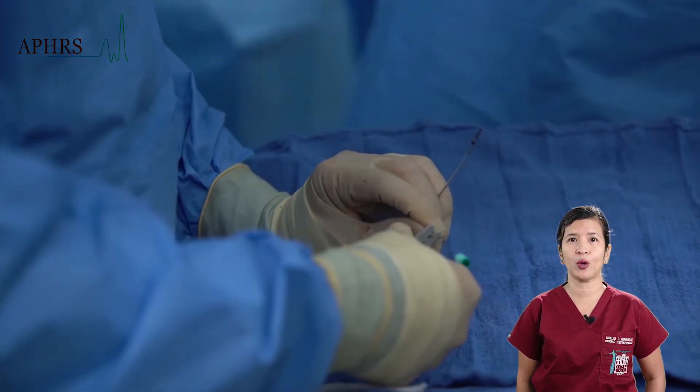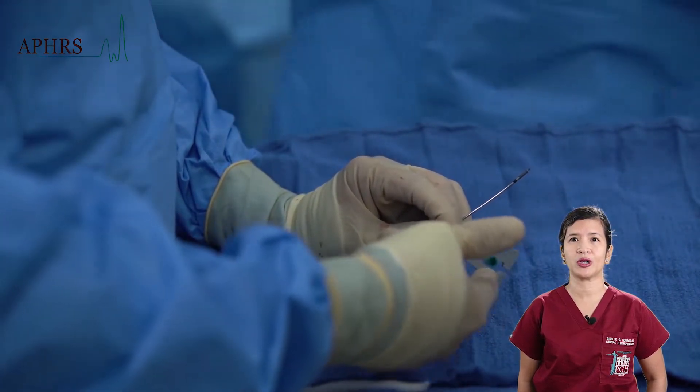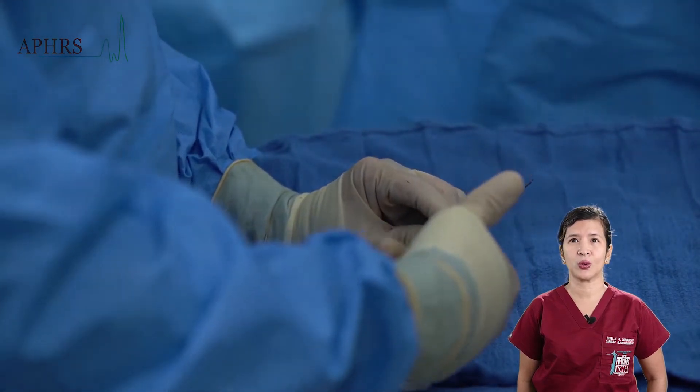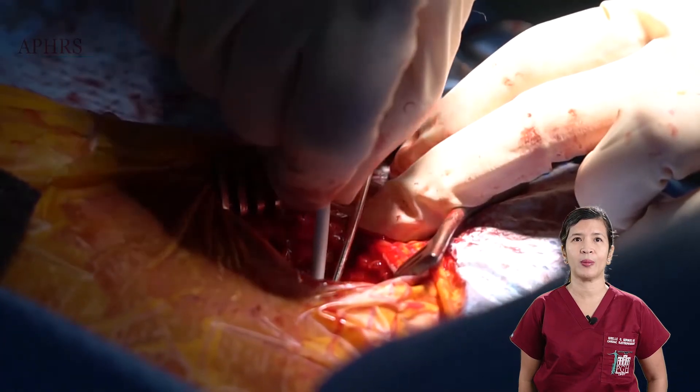Once fully deployed, the screw is then retracted by turning the pinching tool counterclockwise. Care must be taken to make sure that the screw is fully retracted before attempting to insert it into the body.